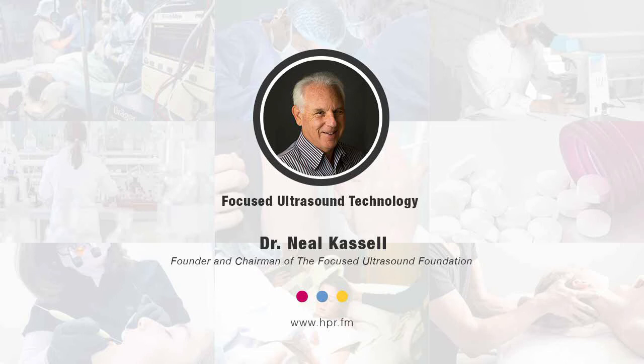No, in a number of instances, it is a good alternative for things that are the current standard of care, like surgery, for patients where it's either contraindicated because of their general medical condition, the comorbidities you talked about, or patients who simply don't want the risk of surgery. So it's a good alternative in those instances.